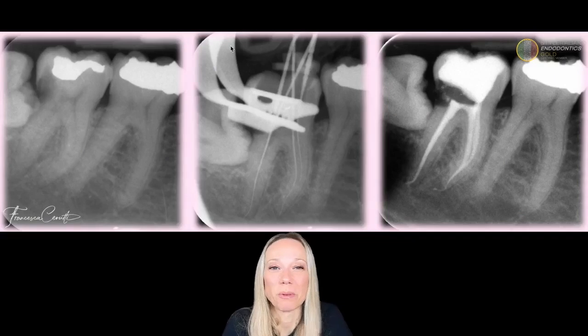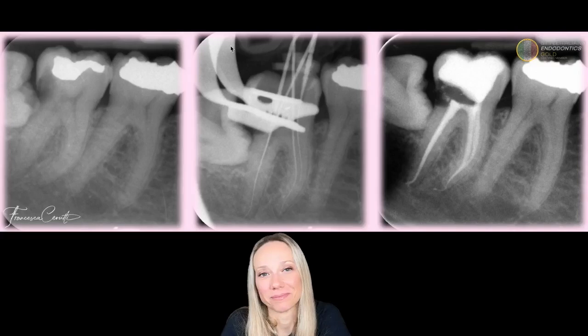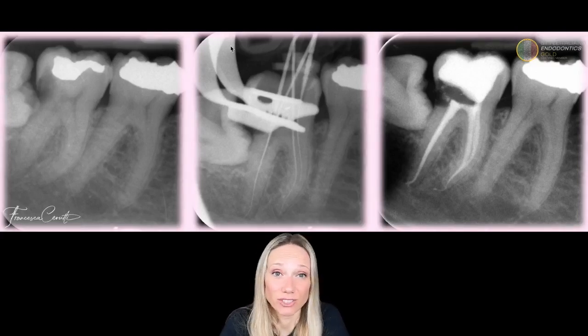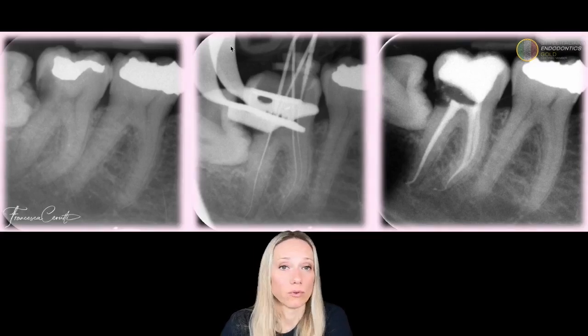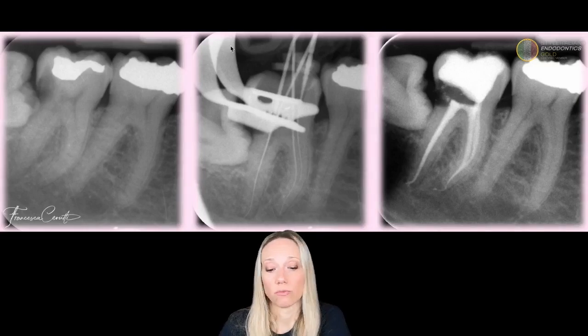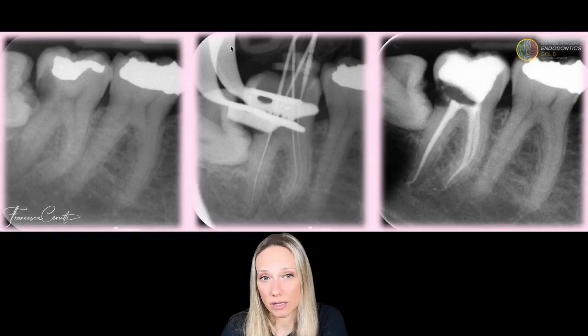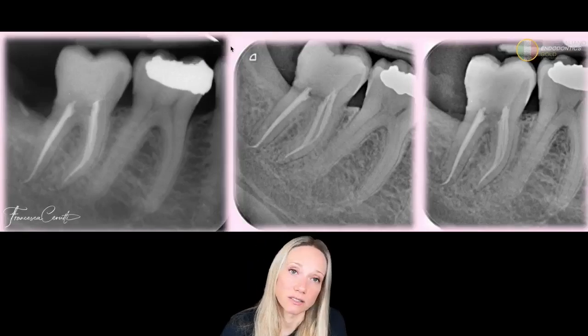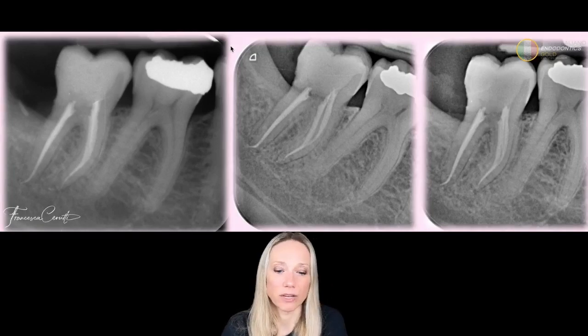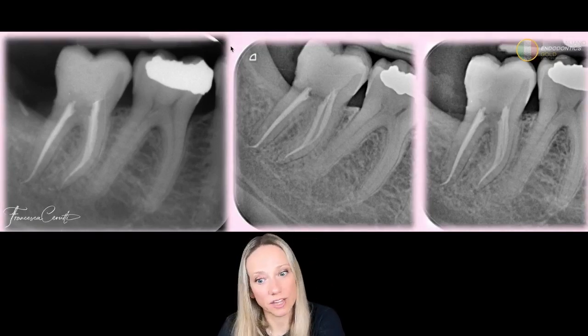Same here. I like second lower molars, evidently. In this case, the problem was due to the impacted tooth that had helped the development of a very large decay on the lower 7. And so what do I do? I remove all the existing coronal restoration, remove the decay, do the treatment, but in this case I do not restore immediately because I can't. So once the patient extracts the lower wisdom tooth, then I do the restoration. And you see the 1-2 years follow-up of this case.